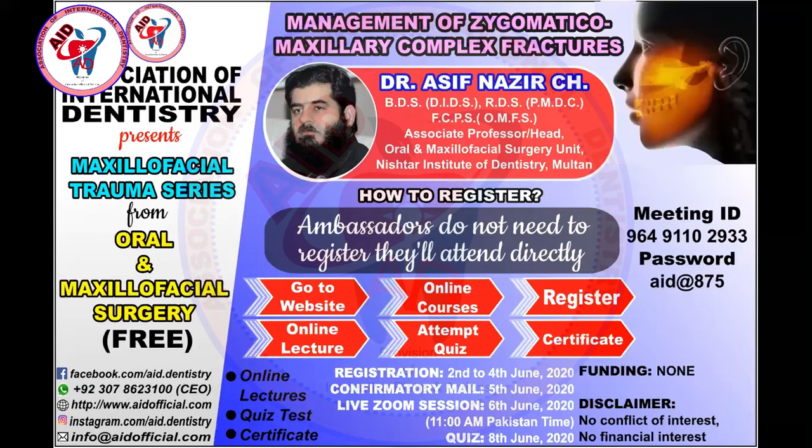Or when the bone grows, they may get submerged within the bone, and they have some effect on the growth also. We need to remove these plates in case of children if you are using non-resorbable mini plates or micro plates. But the problem with the resorbable plates is that they are relatively technique sensitive and difficult to use. Moreover, they are relatively expensive, and not every patient can afford them. But definitely, resorbable plates should be preferred in case of children.